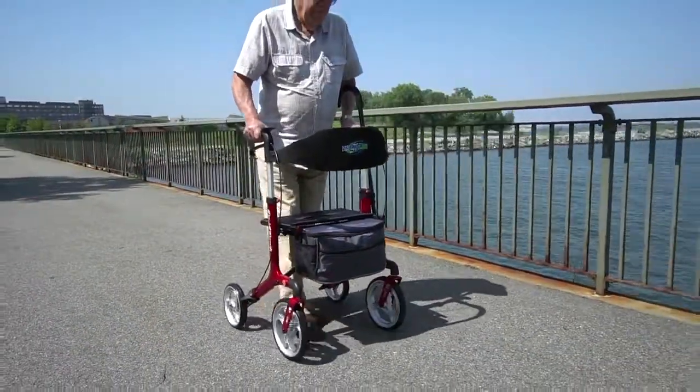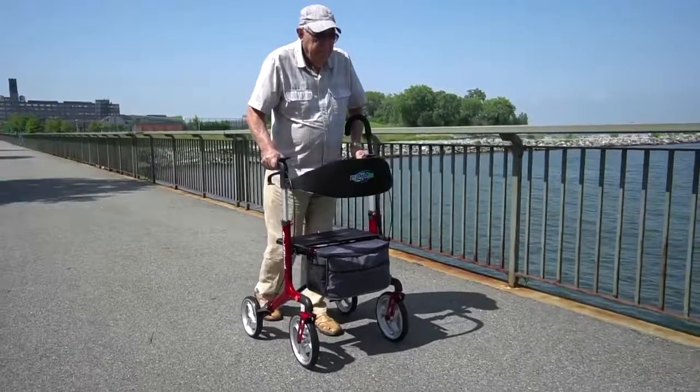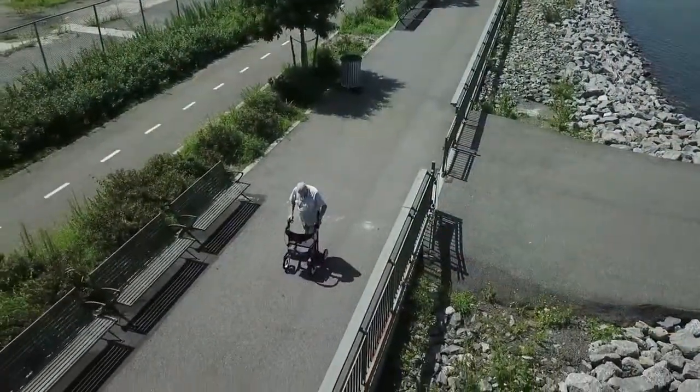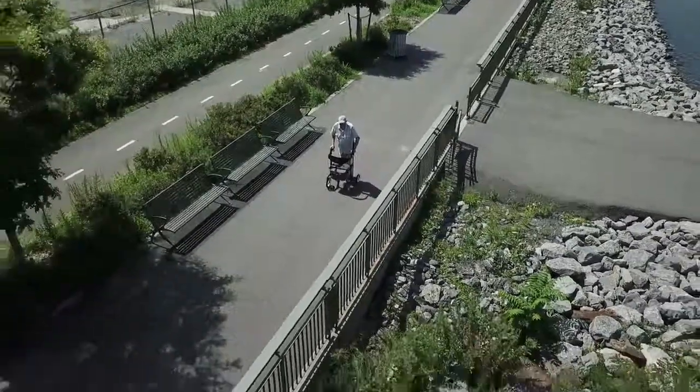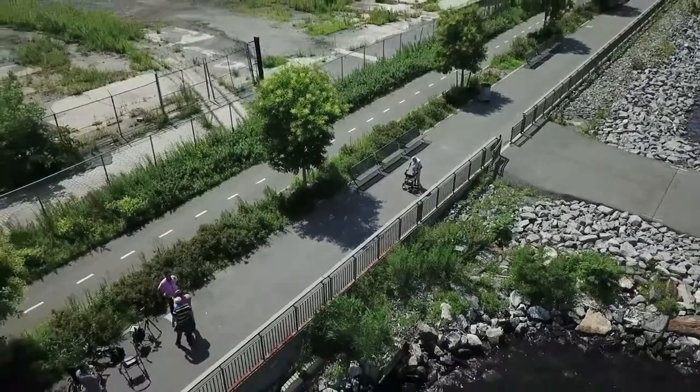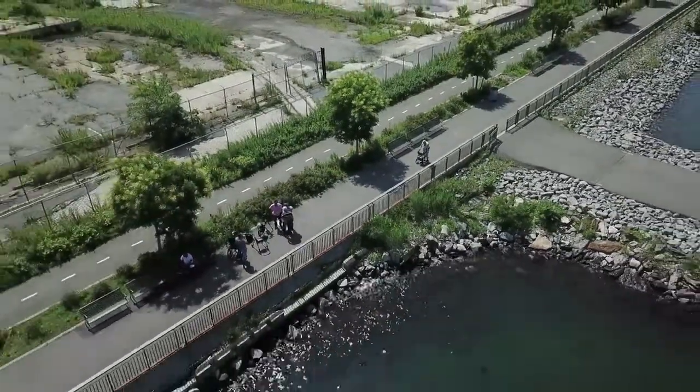Easy to assemble, beautiful, sturdy and reliable, the Atlantis rollator with the seat, back support, storage bag, and a cane holder from Healthline USA will help you go wherever you want, whenever you want, and enjoy the fully active lifestyle you truly deserve.